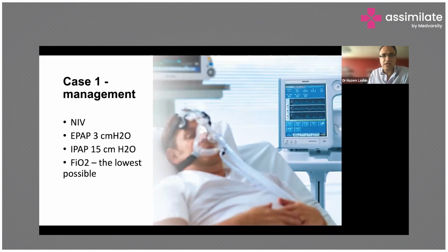Usually, the guidelines suggest that we start with an EPAP of 3 centimeters of water and an IPAP of 15 centimeters of water, and the lowest oxygen fraction that you can use in order to maintain the 88 to 92 saturation.